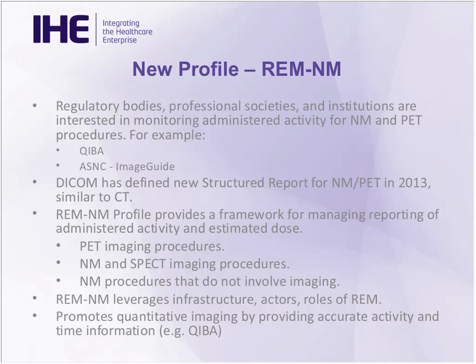We know that ASNC, through their ImageGuide program, is doing collection of dose information as well. So we know there are several societies that are interested in collecting this information. In 2013, DICOM produced the new structured report that's used for these reports for NM and PET. And so now we have the profile coming along.